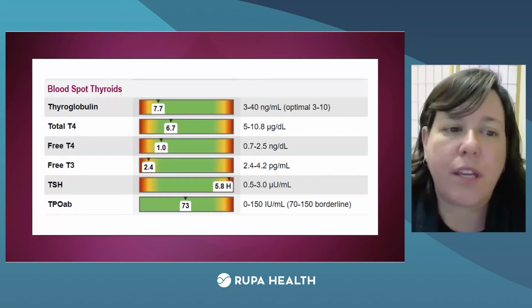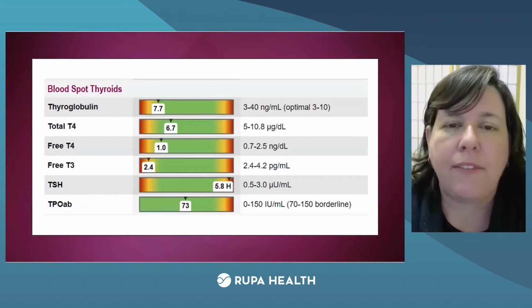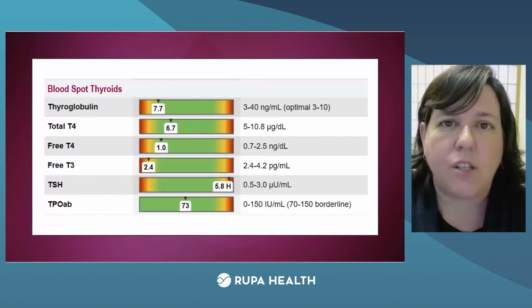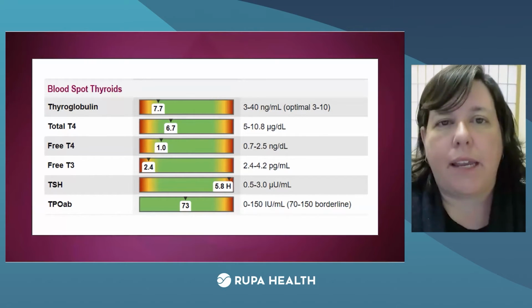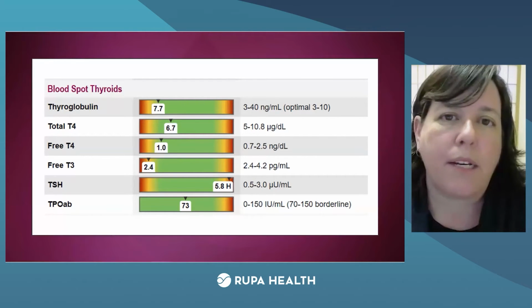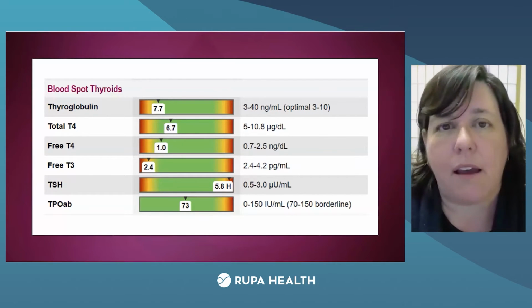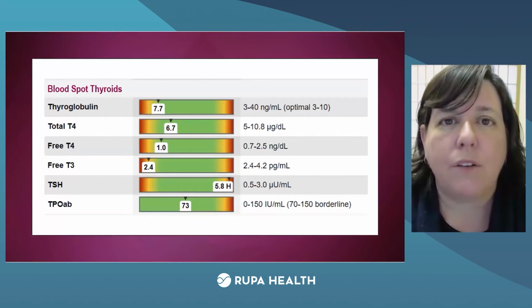But this is the case that is really common. And I think this person would show up in most people's practice and they'd go, oh yeah, this is subclinical hypothyroidism. We've got a high TSH. We've got normal T4s, normal T3s, right? And negative antibodies. And this is someone whose thyroid isn't working well. I think most people would catch that. I have seen it missed. I have seen people say, oh, you're fine, because sometimes more testing confuses people.